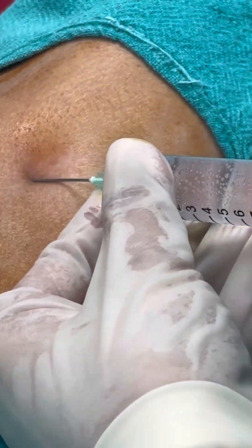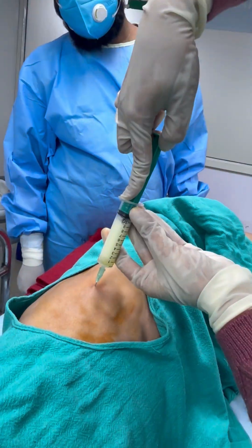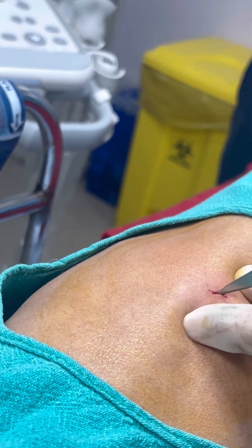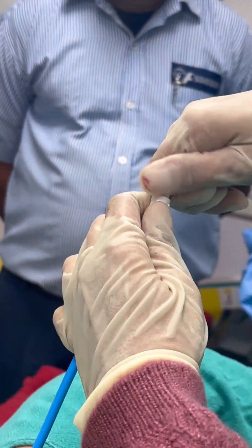Take 15 to 20 ml xylocaine and give it layer by layer. Once you enter the pleura, just suck out and confirm your diagnosis. Then take a blade and give a one-centimeter skin incision. Then pierce with the tip of the pigtail.